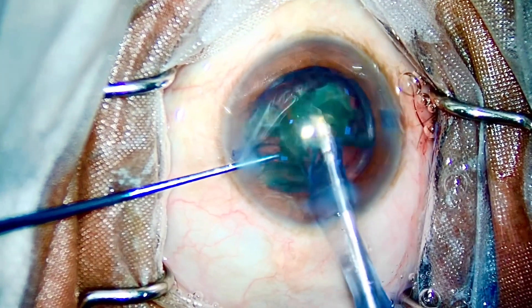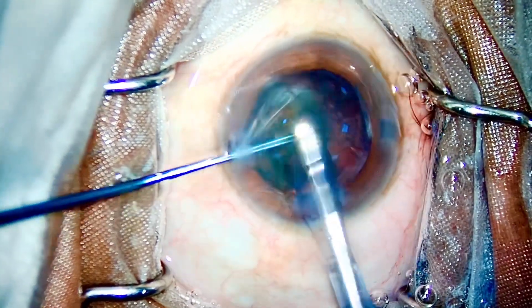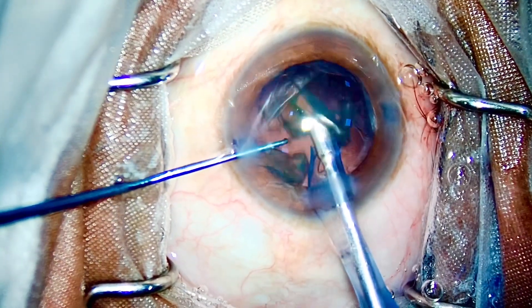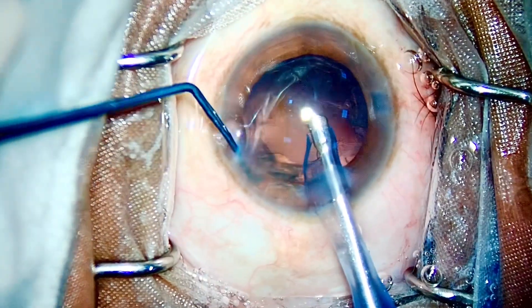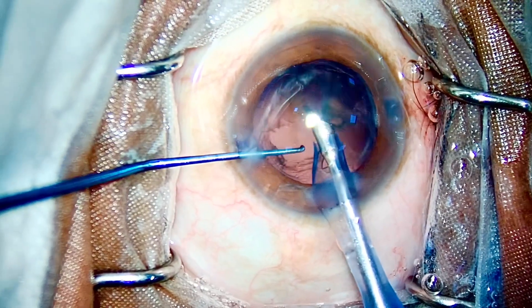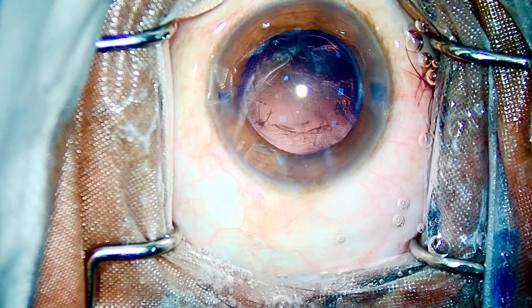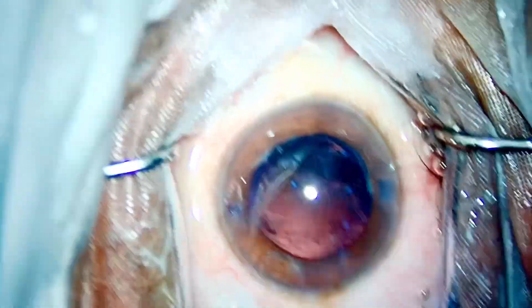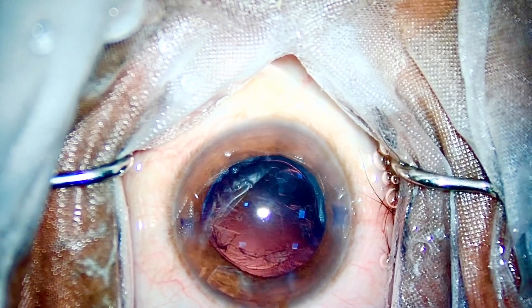Just 10 seconds into the phaco part, I have finished the nucleus — no chop required. My chopper was holding stable; I did not cut the nucleus. This is the last nuclear piece going in. Don't you feel it is one of the fastest techniques to master? Yes, it is.